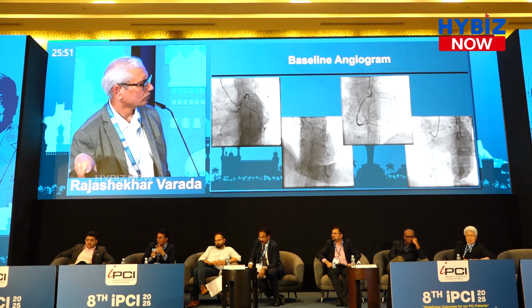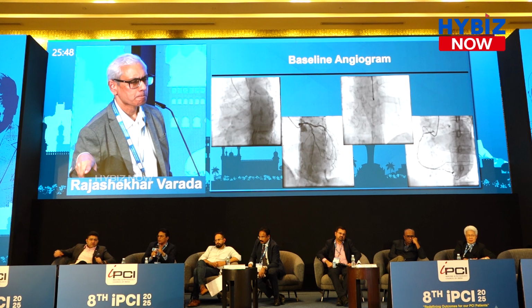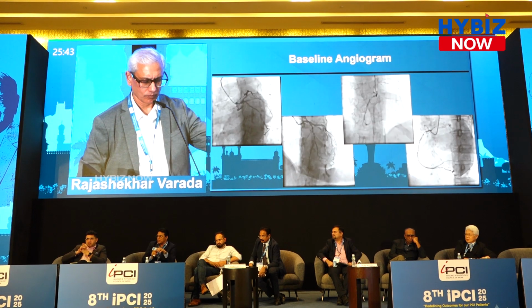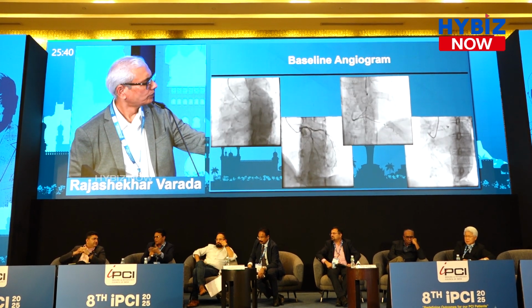If the IVUS image shows a severe calcific nodule, based upon that we'll decide. If there is concentric or deep calcium, based upon that. But I personally feel that for this calcium, any device works well, but if really eccentric calcium is there, I am worried about the IVL or balloon-based strategies. Eccentric calcium is more dangerous. When eccentric calcium or a calcium nodule is there, always do the plaque modification adequately with the orbital, in a bigger vessel, definitely. Or else you can do the wire bias and the rota can be done. That's it.